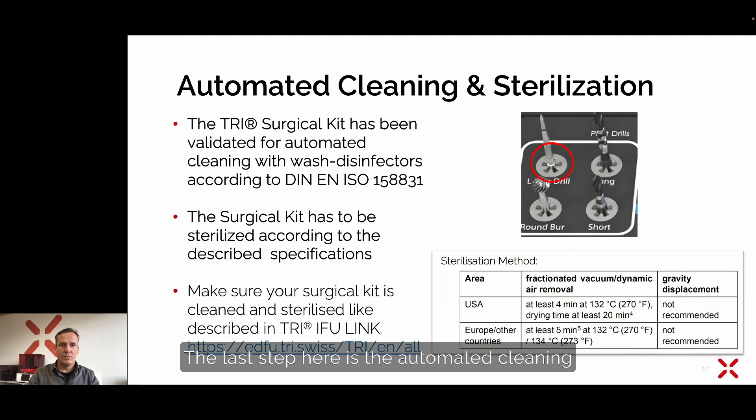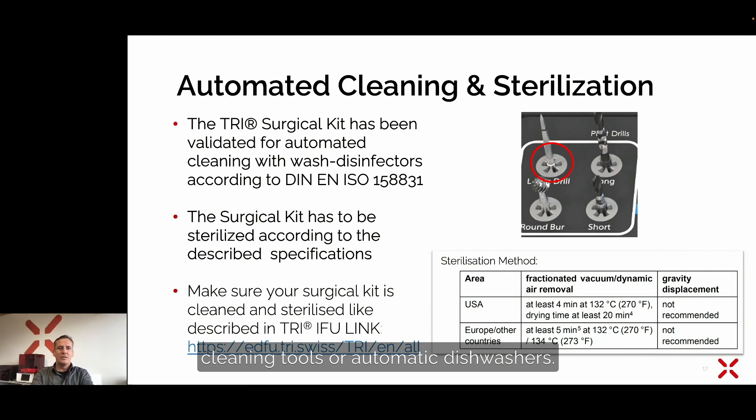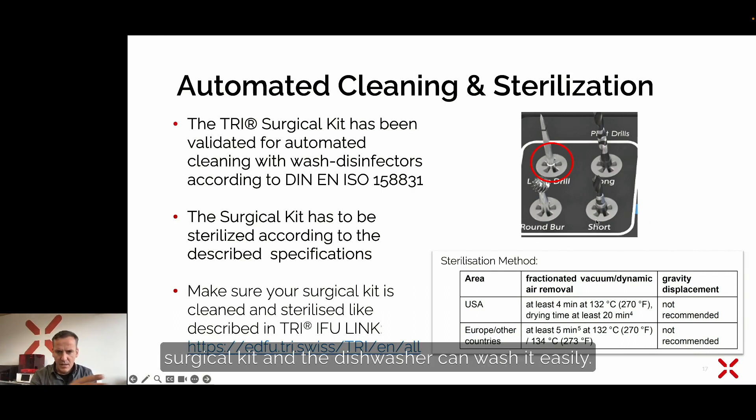The last step is automated cleaning and sterilization. We have included in our surgical kit these holders, which are available according to the norm for automatic cleaning tools or automatic dishwashers. You can leave the tools inside of the surgical kit and the dishwasher can wash them easily. It is necessary that you download the instruction for use, as it includes all information needed for the sterilization process. Please go to our website and make sure you download and print out the instruction for use for the TRI implants.